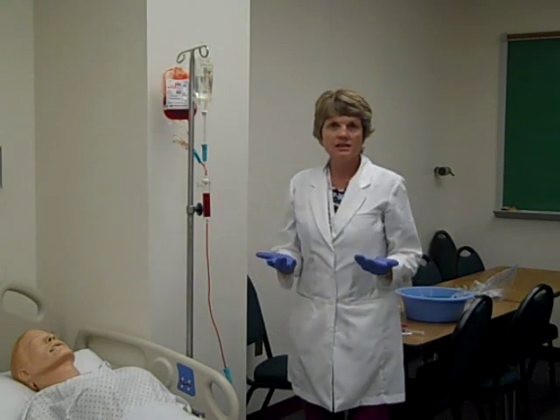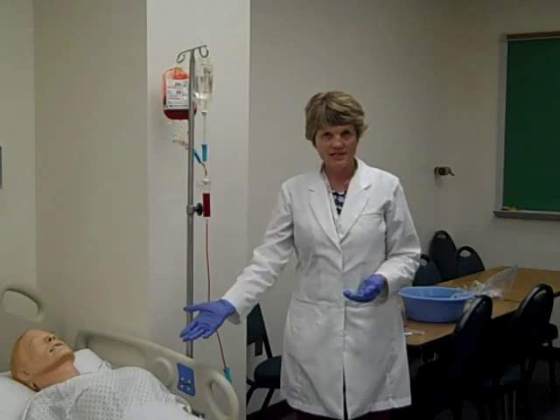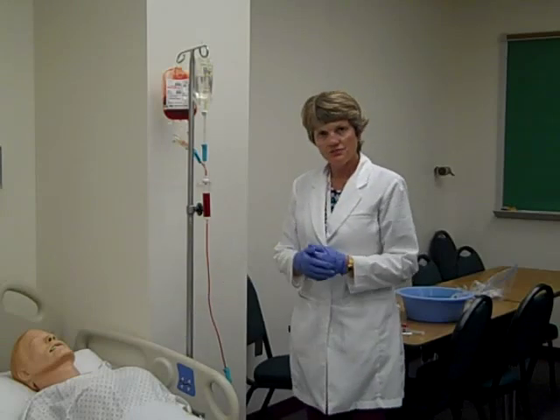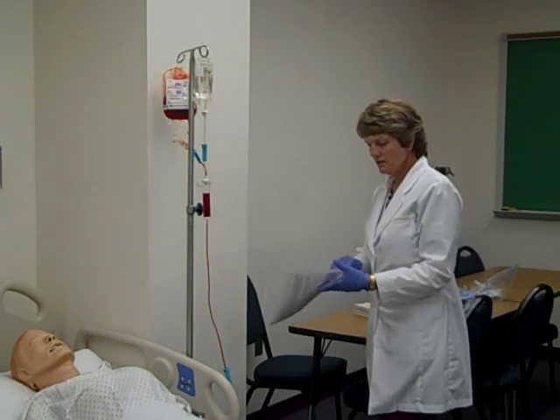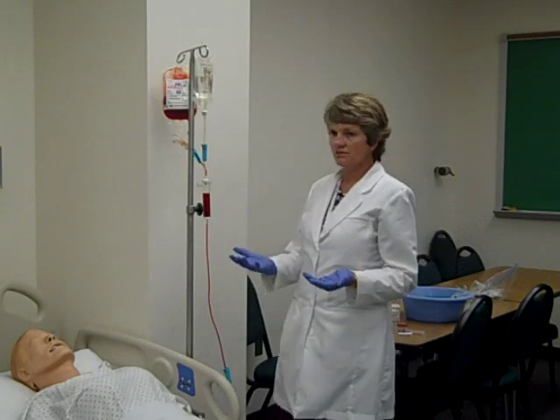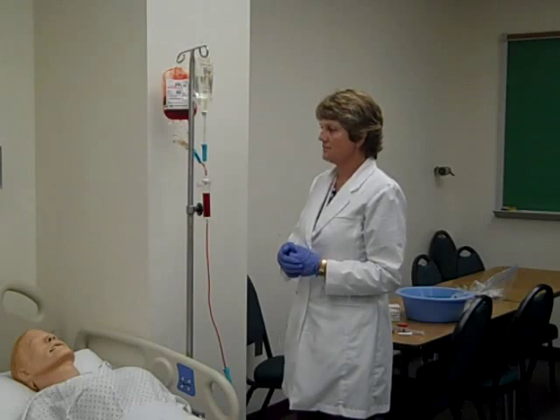So for time's sake here, we're going to say that 15 minutes is up, and I'm going to retake vital signs on the patient. And vital signs are fine. I'm going to document them on the requisition form. And I'm going to proceed to follow the hospital policy, because each policy is different at each hospital.